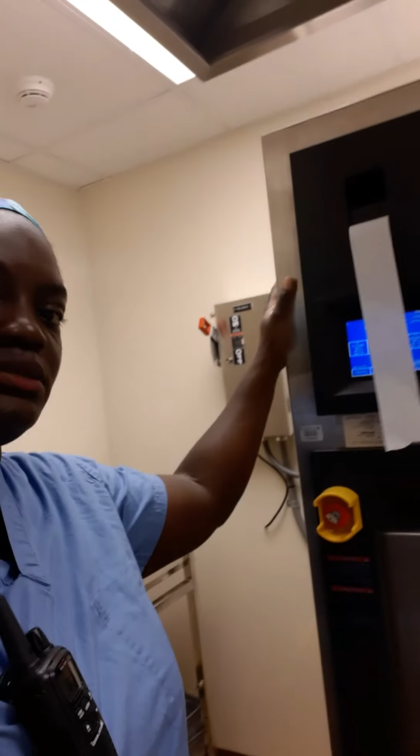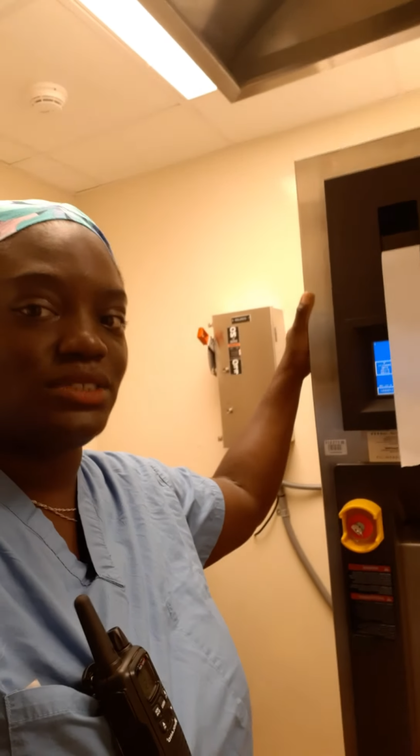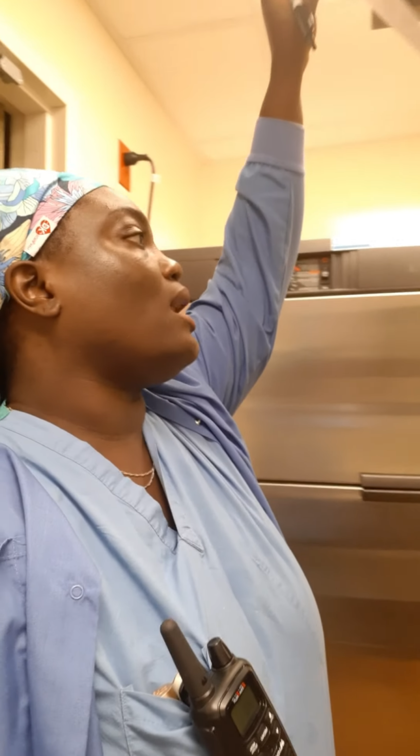After we flush the machine, we have to let it warm up because it's really cold. These things get up to 272 degrees Fahrenheit, and so we have to let this jacket warm up. After that, we do three tests every week, and then daily, we do two tests. So it's usually a lot of testing of the machines to make sure they work, and a lot of documentation. Okay, that takes about an hour and a half to get all the tests done.